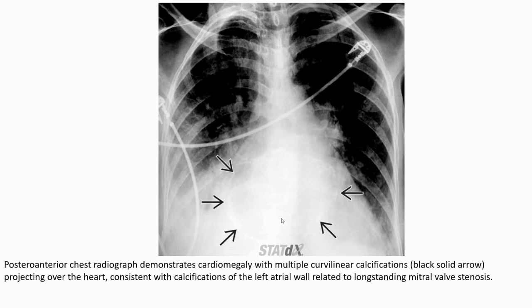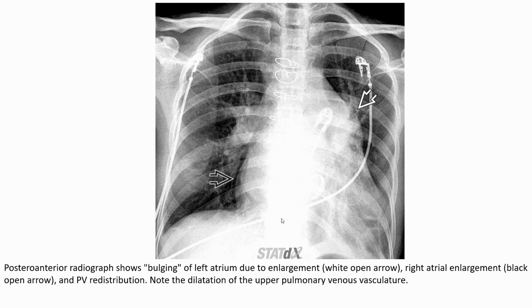This radiograph demonstrates, on the lateral view, multiple curvilinear calcifications indicated by the black solid arrow, projecting over the cardiac shadow, consistent with calcification of the left atrial wall related to long-standing mitral valve stenosis. This radiograph also shows bowing of the right atrium due to right atrium enlargement, and pulmonary venous redistribution with dilatation of the upper pulmonary vessels.